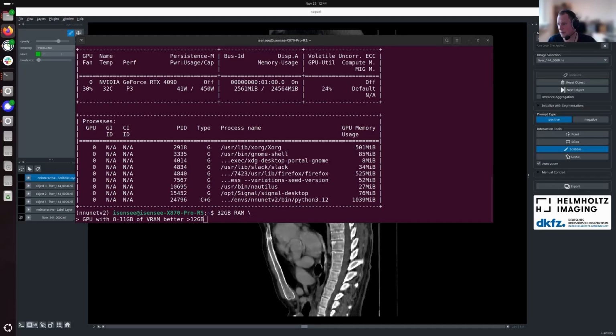So it also works with anisotropic images. But of course, as soon as you get very thick slices and objects move a lot between slices, it starts to break down. In principle, there are no issues with anisotropic images, also because we see this a lot in the training dataset, say an in-plane resolution of 1 millimeter but out-of-plane 5 millimeters. Something like a 5:1 ratio is something we have seen in training and we should be able to deal with.